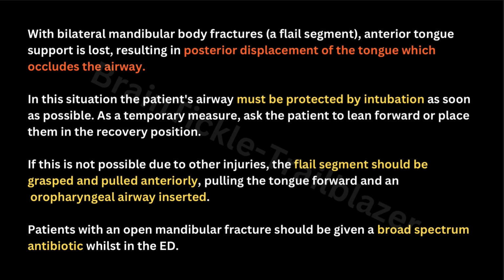I hope you understood what an orthopentomogram is, what mandibular fractures look like, and what you need to do as an ER physician. I hope you understood this.